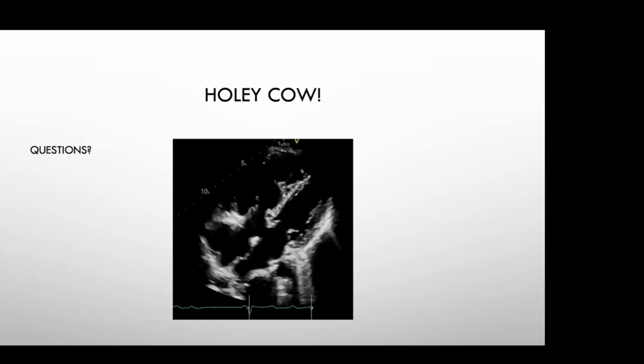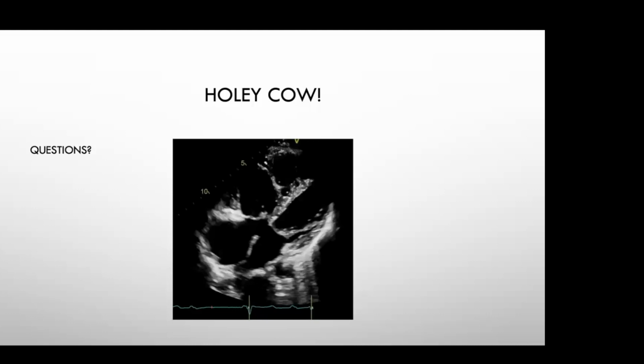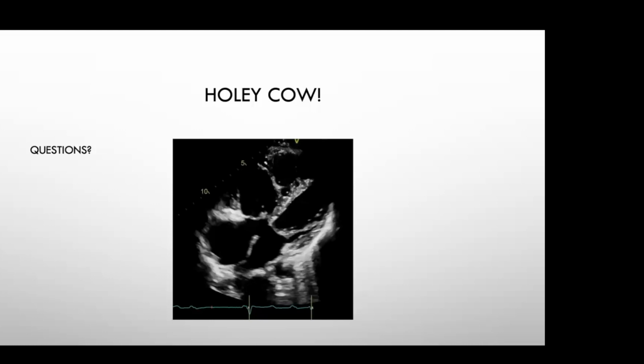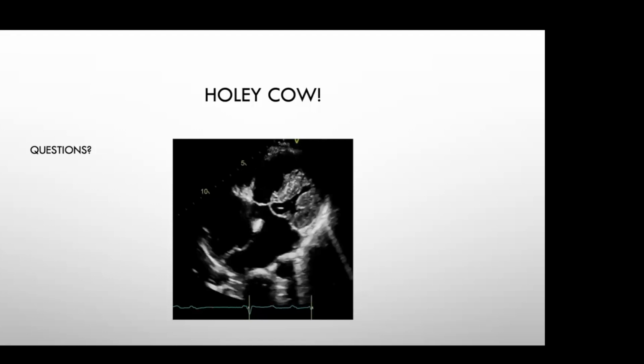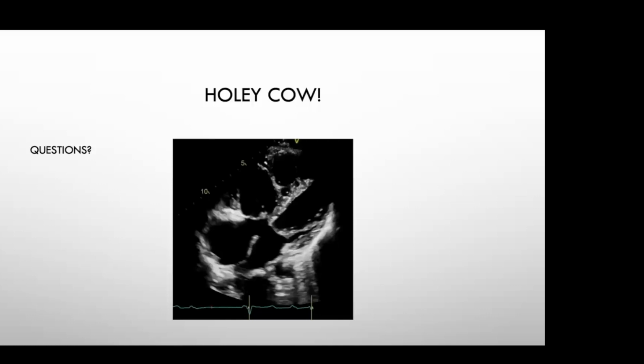Color, because the ASD or atrial flow here is low, you really have to bring that color scale down to at least within 40 to 50 centimeters per second. Yeah, that's helpful.